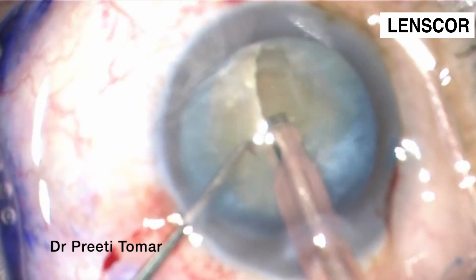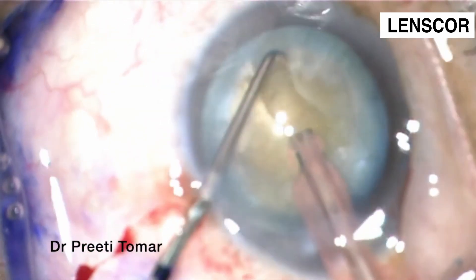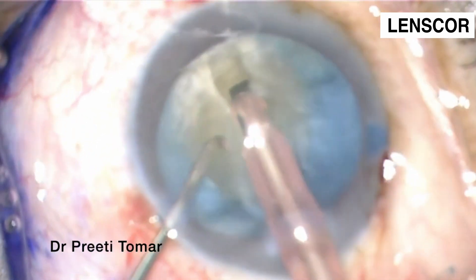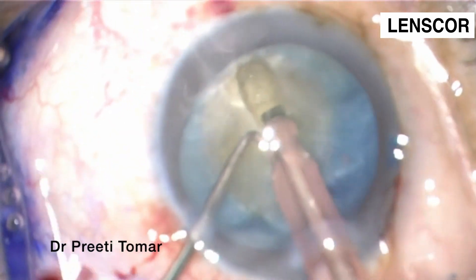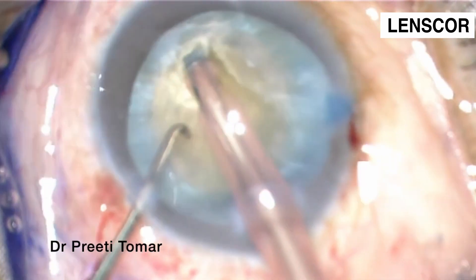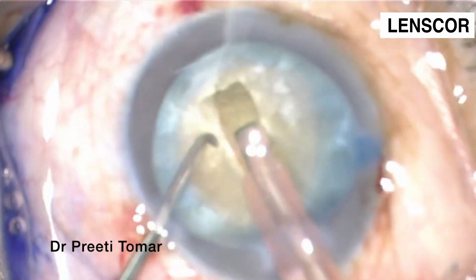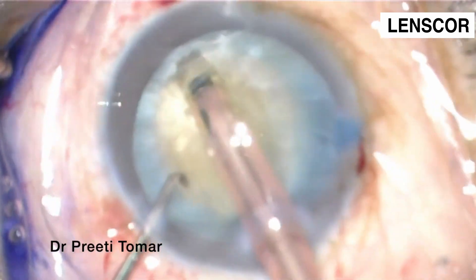We have made a groove and are trying to widen it so that it accommodates both the tip and the sleeve of the FACO probe. One should make sure to stabilize the nucleus while doing sculpting.